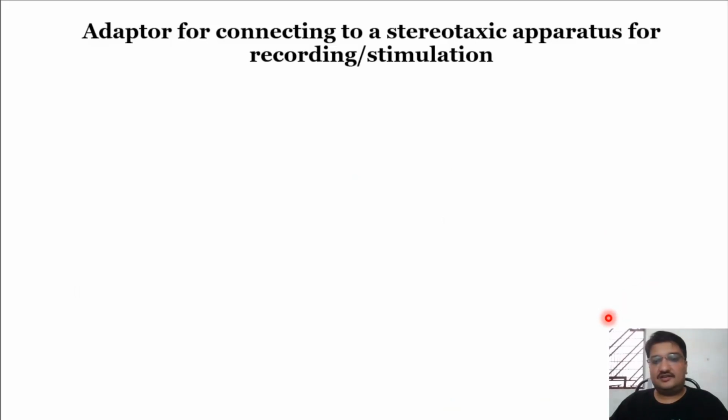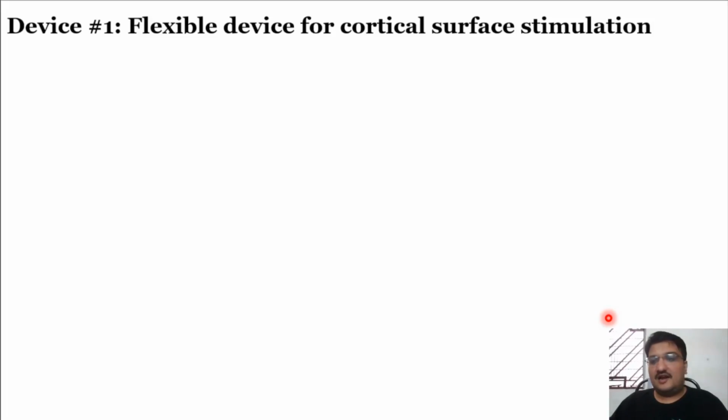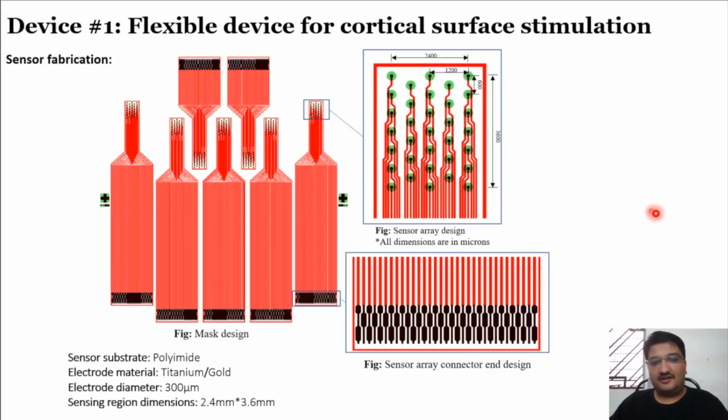Now we will touch upon another very important topic, that is, as I mentioned, brain stimulation, deep brain stimulation. Again, the acquisition part of microelectrodes remains the same. You can see this is one of the designs, or mask design I should say, for the fabrication of your electrode. All the images are shown. This part basically is your electrode. Again, the dimensions and all are provided, whereas the bottom part is nothing but your contact pad. If you can see, the length of your electrode differs here.